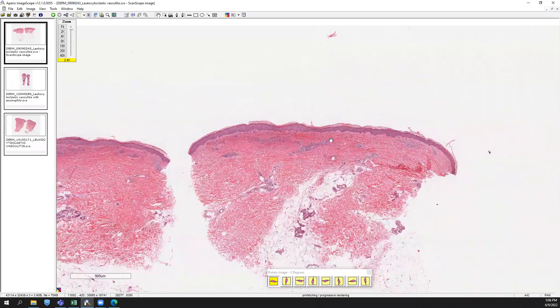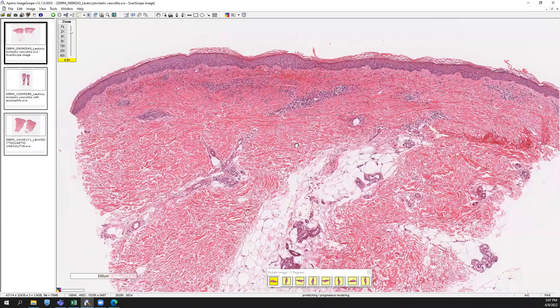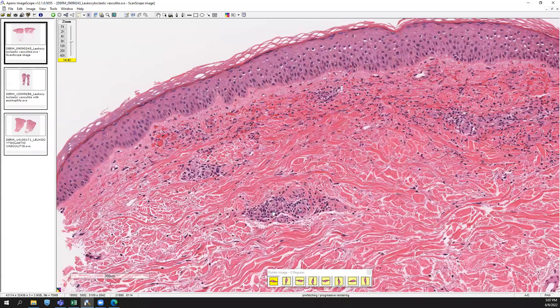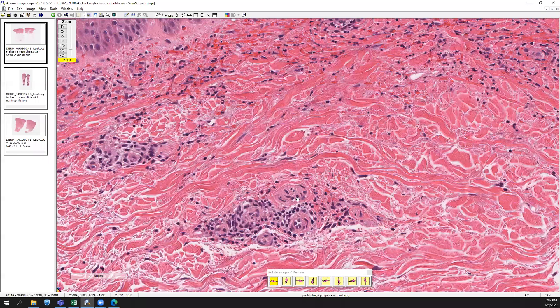Here you can see a punch biopsy where the inflammation appears to be restricted to the upper dermis. Moving in on higher power, you will see a perivascular lymphocytic infiltrate, but you also notice areas where the lumen appears smudgy and pink — we call that fibrinoid necrosis — and you can have an evolution to the perivascular inflammation.